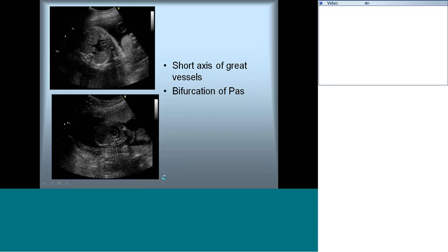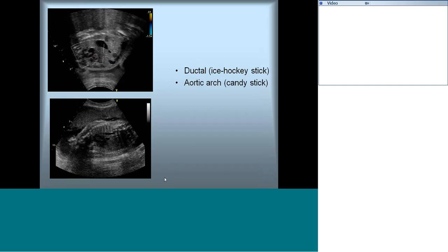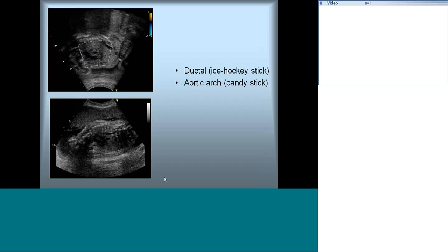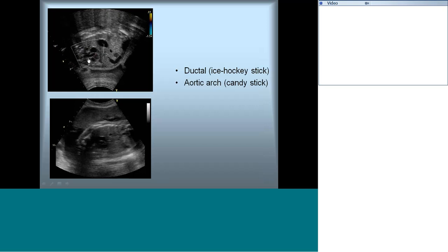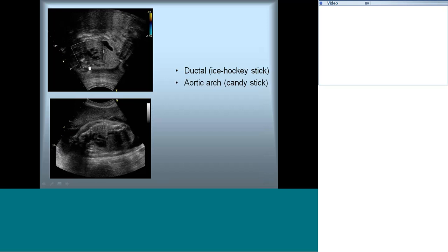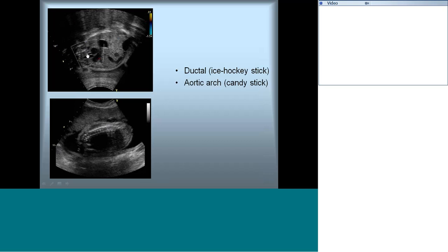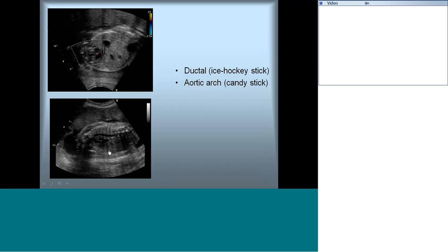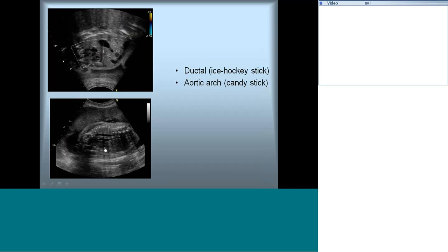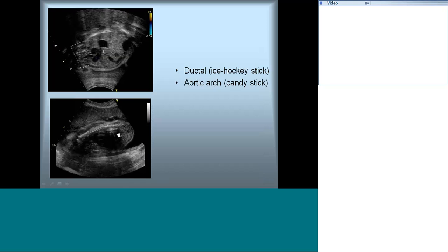The ductal and aortic arches need to be seen separately. The ductal arch is like an ice hockey stick — it is much more horizontal, starts anteriorly, and continues into the descending aorta without giving rise to arch vessels. The velocity of the ductal arch is always higher than the aortic arch. The aortic arch is like a candy cane, and it rises just next to the SVC, gives rise to arch vessels, and continues into the descending aorta.